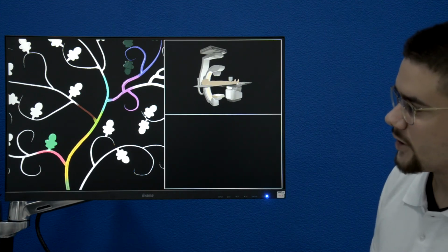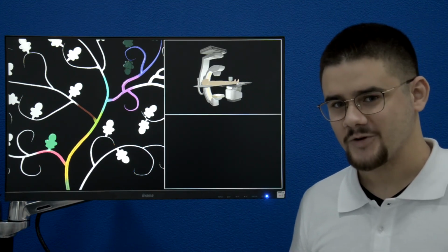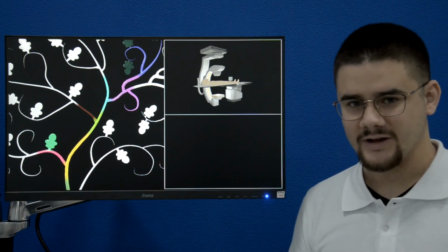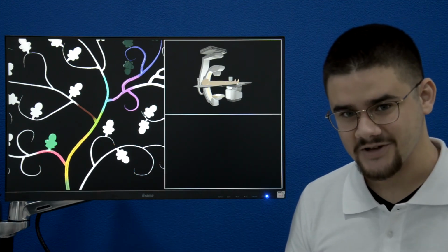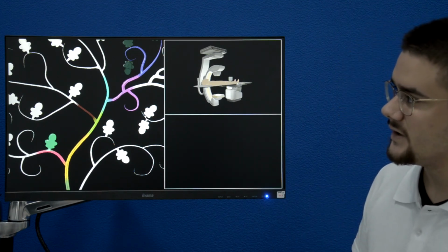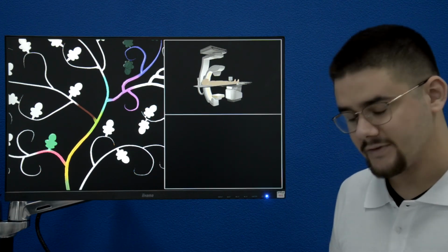In general, when working with intricate anatomies, you can get into any vessel and not only the programmed ones. However, you can also damage the vessel that you're working on, and this will introduce complications. Also, with the feedback, when you are operating, you can feel the tension and the resistance up to a complete stop of the introduced instrument.